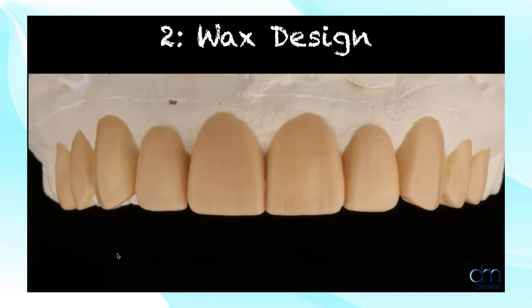So we can see the wax, how good it is, how good they are at following that design down to the millimeter, down to the half a millimeter. Whenever I take these photographs, I tell the lab, you know what, I want half a millimeter more on the incisal, or maybe I'm going to do a little bit of gingivectomy. And they're really good at following all that.